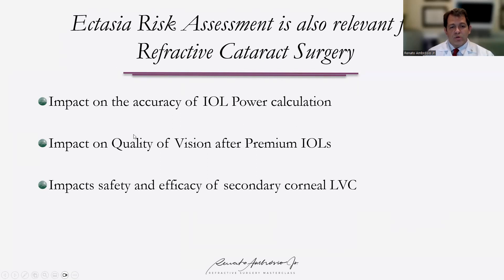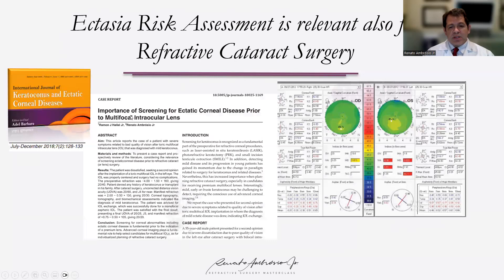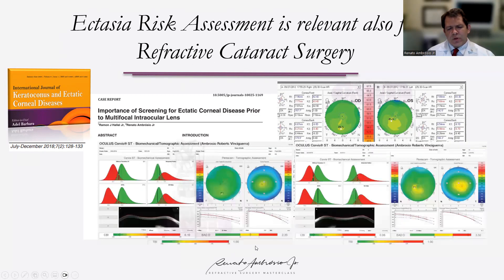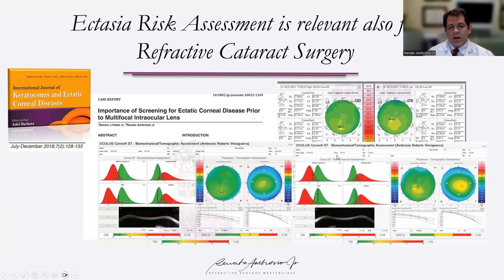You need to understand if the patient has mild keratoconus, subclinical keratoconus, or a susceptible cornea. This patient was nicely operated — given a multifocal toric IOL, very motivated for distance and near vision. He had some astigmatism and the colleague did a perfect surgery with a perfect toric IOL implantation, but did not look at the cornea properly. This patient has low-K keratoconus on Scheimpflug tomography and integrated imaging — you can see a TBI of one in both eyes. It is a thin, steepened cornea. Understanding this is important to note before surgery. We changed to an aspheric IOL and the patient was very happy.